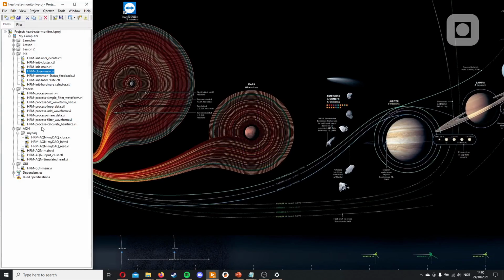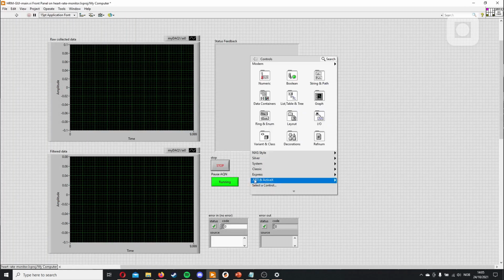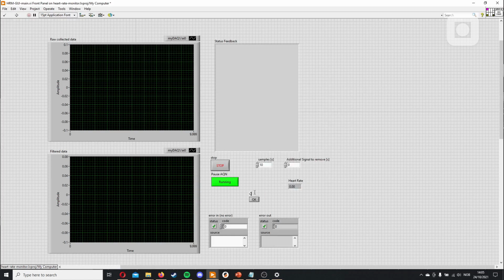The next thing we can do is to go into the GUI and add a button for it. So we'll just do it the same as every time. Clear waveform. Call it clear waveform. We can have a clear stored waveform. You can use the whole name. It's free.